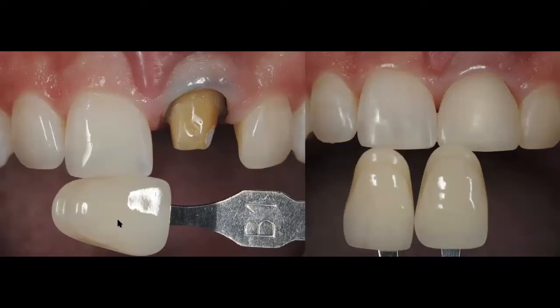So this tells my lab, well, hey, if I'm going to use Emax, I know that I have light Emax ingots. Or the question may arise, would it be better for me to use zirconia, at least a zirconia substrate, and then layer some ceramic on top of that zirconia substrate so that I can hide this stump? And that is why that stump photo is so important, and also the importance of the lab fabricating that stump for you in their lab.